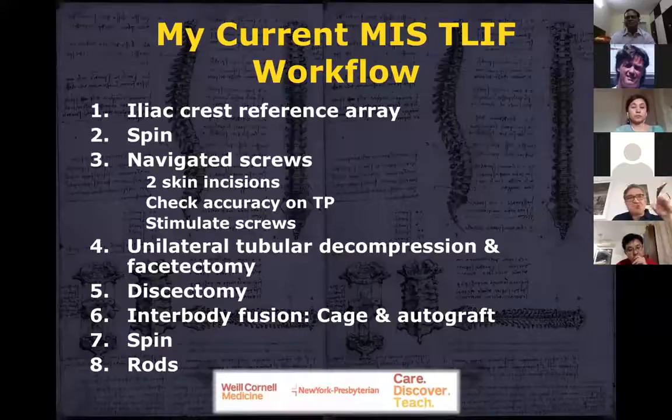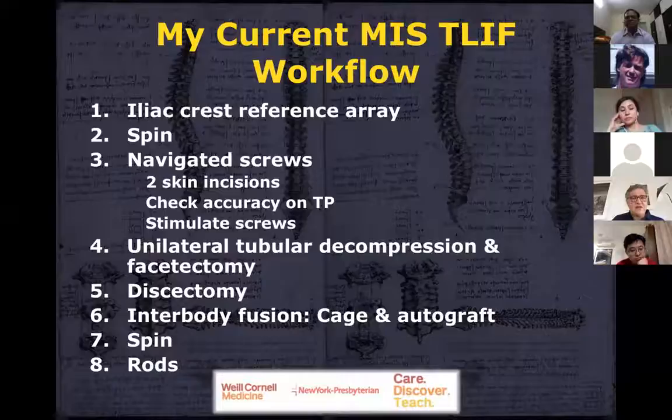Since we don't use fluoroscopy, obviously, you have to make 100% sure that you trust the accuracy of your navigation, and there are certain tricks to do that. And then once we have inserted the screws, we'll put in the tubular retractors. We use navigation for that. We do the discectomy. We do the cage. And then at the end, before we put the rods, we get a final spin to make sure that everything is accurate.